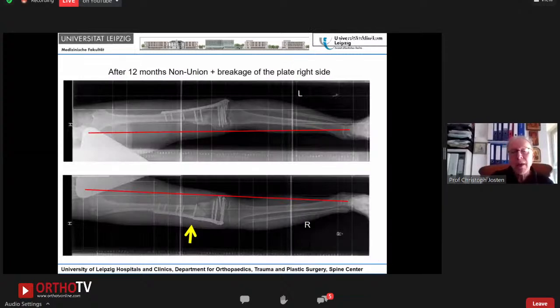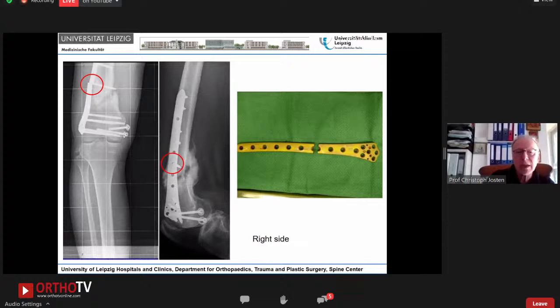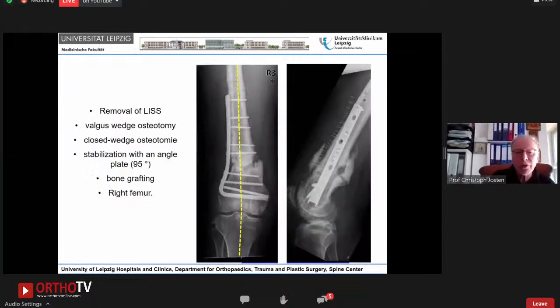And as I mentioned, there must be inappropriate osteosynthesis. You have breakage of the plates and non-unions. And now you see here the breakage of the plate. And be aware, this doesn't have to do anything with an additional medial plate or not. It only depends on the incorrect primary osteosynthesis. This screw is too much because you neutralize the elasticity of the plate by using this lag screw. And even if you would have made a medial plate osteosynthesis, I'm in doubt whether there would have occurred a good healing. So we removed the plate.